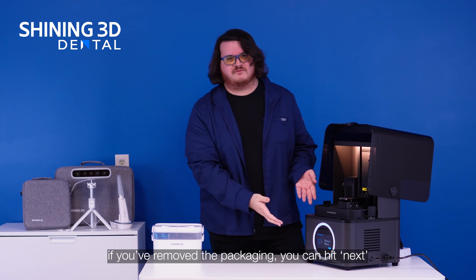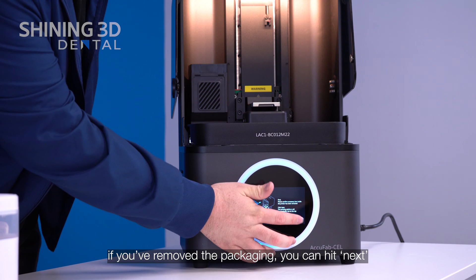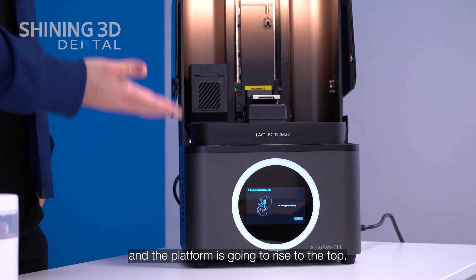At this point, if you remove the packaging, you can hit next and the platform is going to rise to the top.